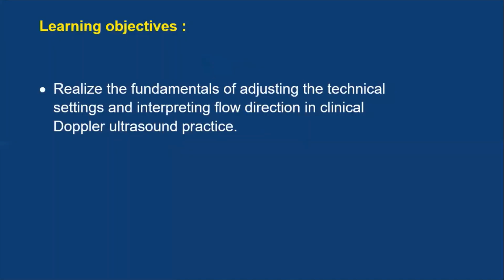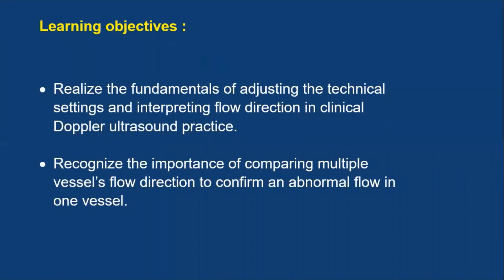So in this presentation, we will have some learning objectives. We will realize the fundamentals of adjusting the technical settings and interpreting flow direction in clinical Doppler ultrasound practice. We will recognize the importance of comparing multiple vessels flow direction to confirm an abnormal flow in one vessel.